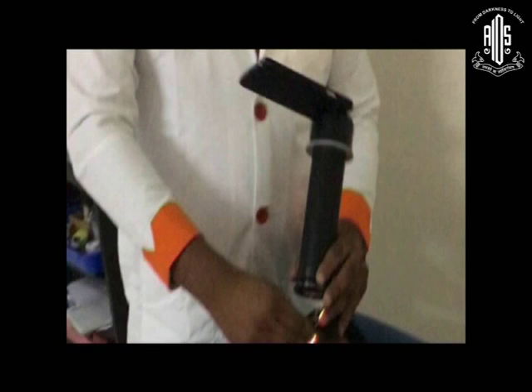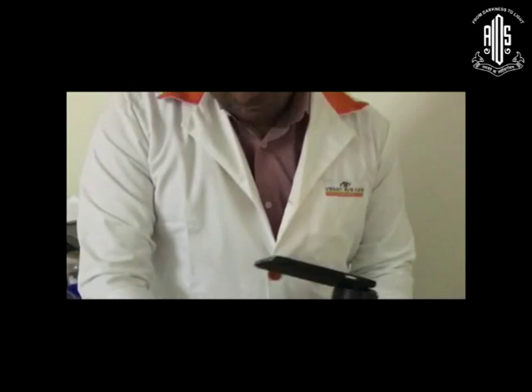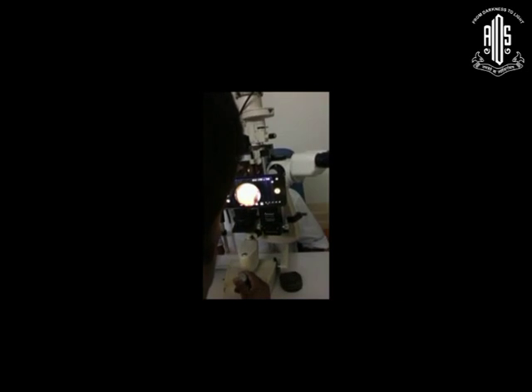There are different ways you can do it. There are no set rules like you should do it only this way. But this is the way I am comfortable, being a retinal person. I like to hold the condensing lens, and that's the way I am doing this technique. I am holding the condensing lens, and that makes your other hand free for indirect ophthalmoscopy with scleral depression. So you can go up to the far periphery with this technique.